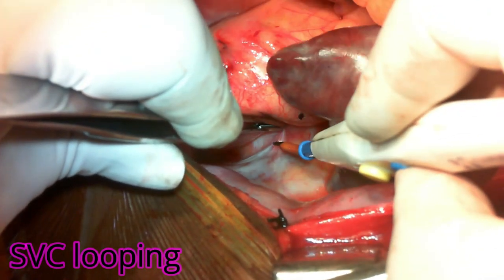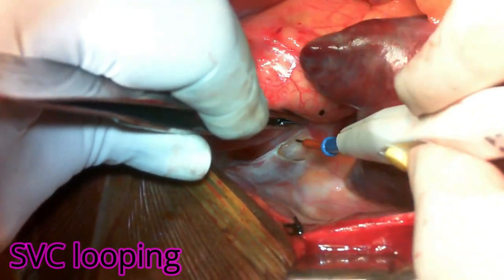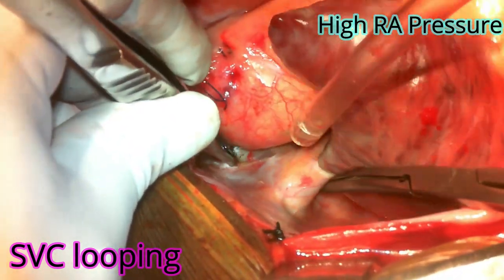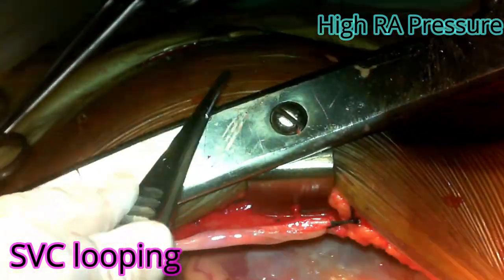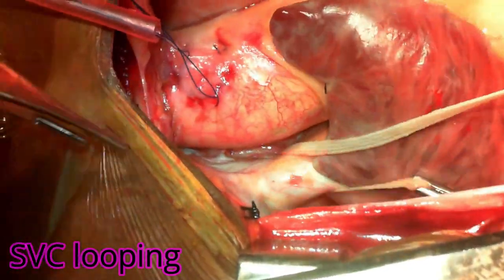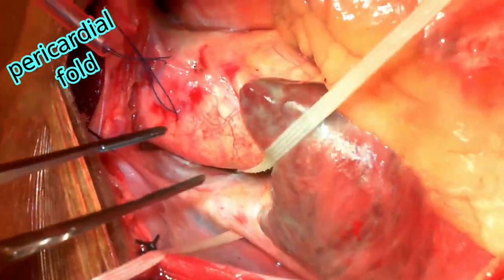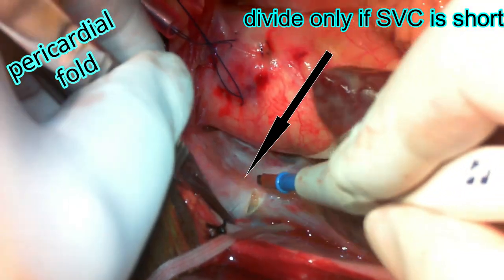Then make preparations to go around the SVC. For this, you have to open the pericardium or the tissues on the right pulmonary artery, on the right side of the ascending aorta, and without much disturbance, go around the SVC and pass in a tape. Make sure you don't injure the sinoatrial node and don't injure the azygous vein. Also make sure you have enough length of SVC — if it is short, open this fold to gain enough length to cannulate.